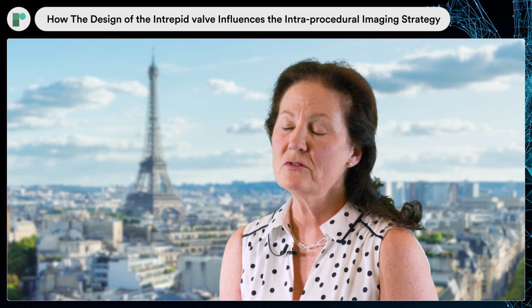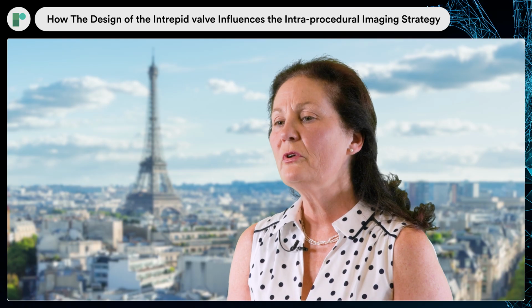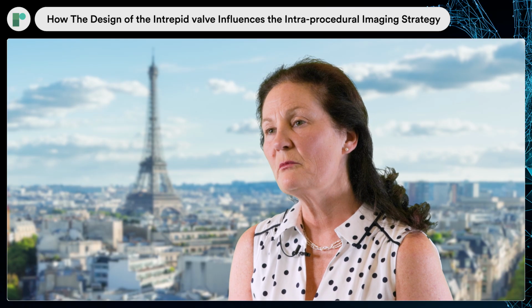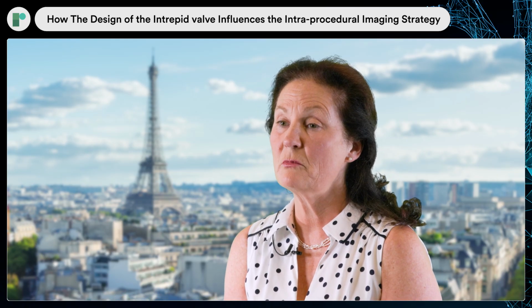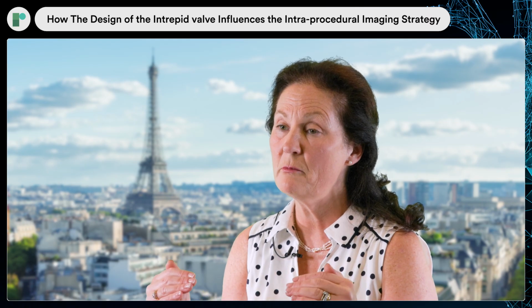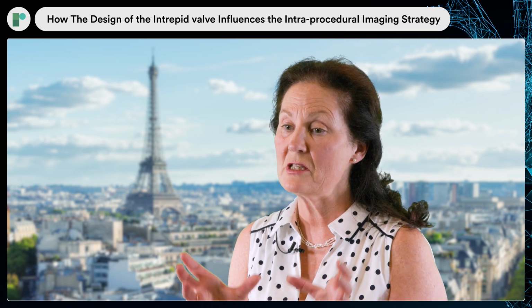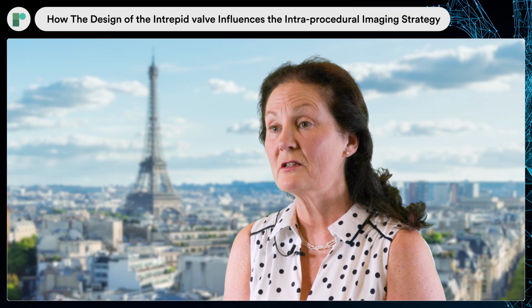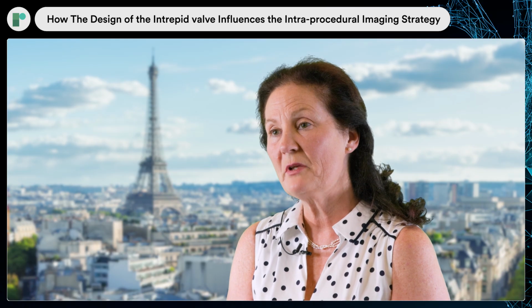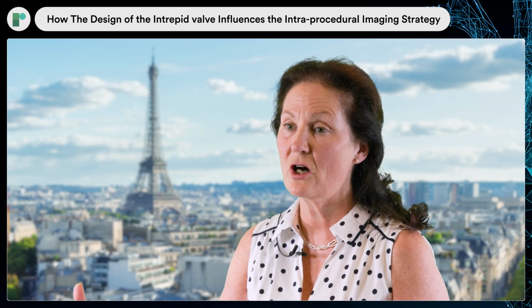To do that, we used to use biplane transesophageal echo imaging, but now with the advent of multiplanar reformatting imaging, it's much easier to look at the bicommissural picture at the same time as a three-chamber view with an en-face 3D image, so that we can make sure that we are at the right depth, the right angulation, and the right orientation of the annulus. We image the annulus and bring the device to the annulus rather than imaging the device itself. So the key is multiplanar reformatting imaging of the mitral valve anatomy itself.